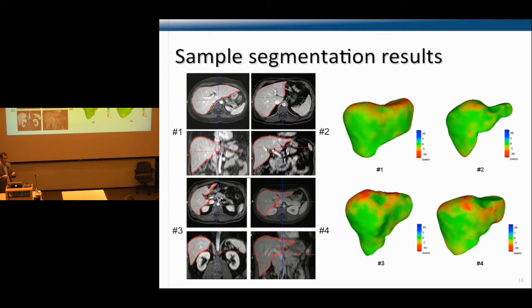So we really need to increase the size of the data set, and we're seeing a trend in medical imaging with a lot of machine learning techniques starting to be used. We really need a well-represented data set to show the different types of liver appearances and different contrast levels, because each patient absorbs the contrast in a different fashion. So we really need a good representative distribution of the images.